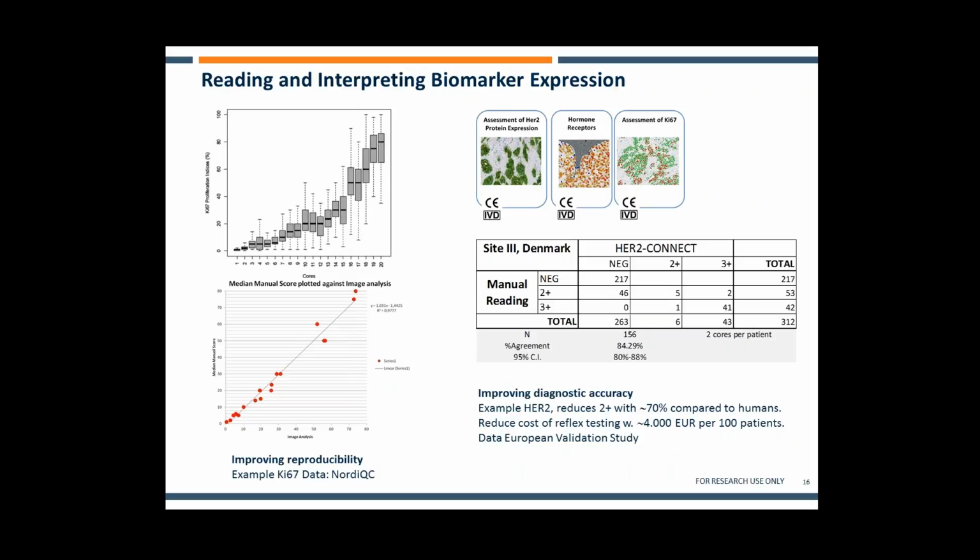So this was a huge study conducted by the Nordic QC. And in that study, it was demonstrated how image analysis can be used to significantly reduce inter-reader variability by using a different method to quantify the tumor areas and then quantify the positive and negative nuclei.